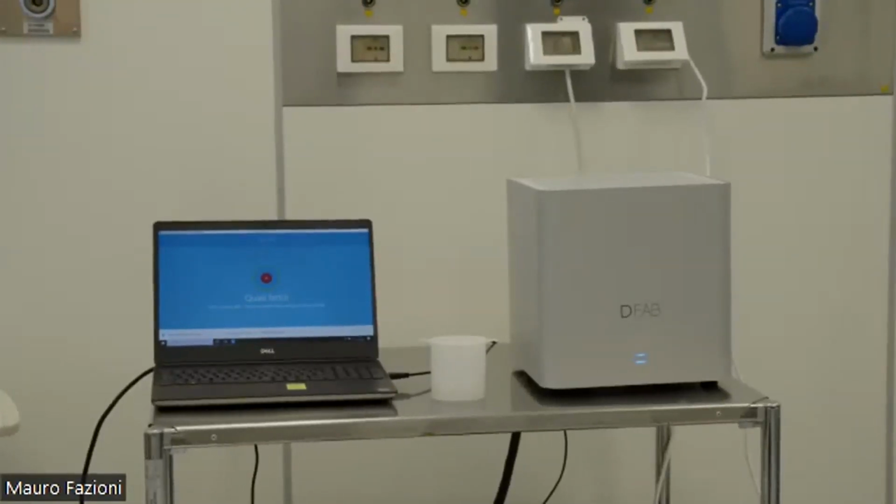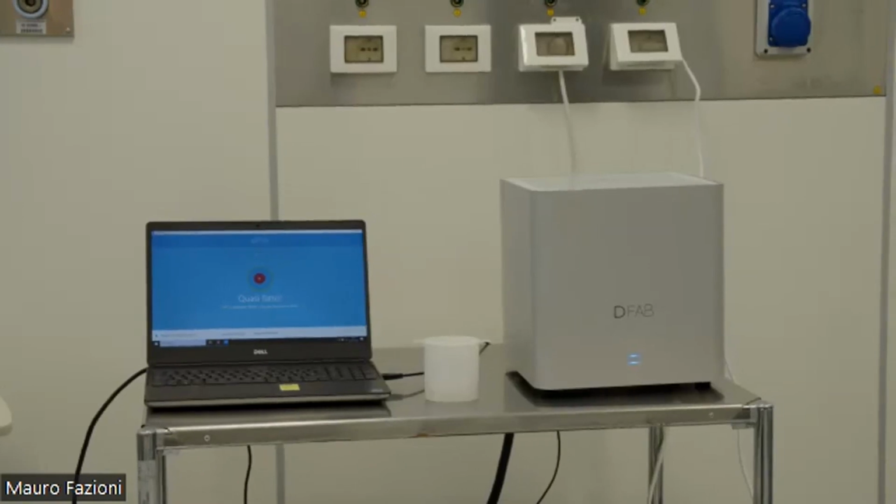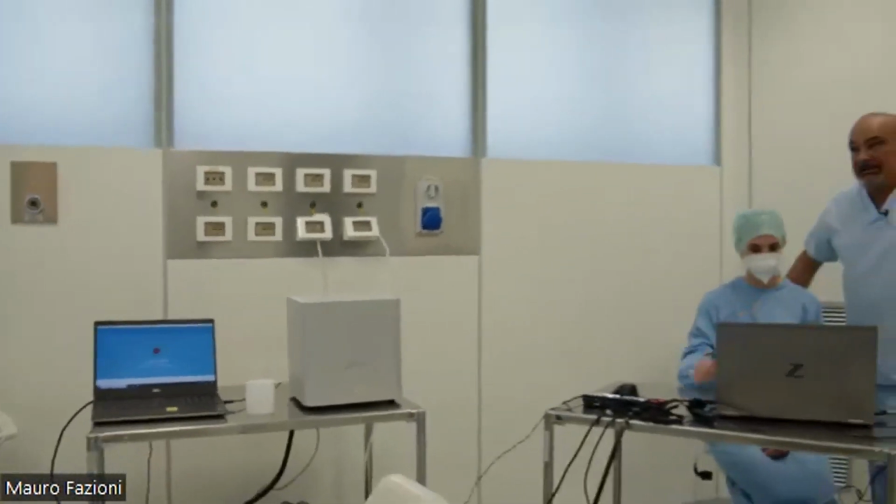One question about glaze for resin. Why do you avoid using glaze resin or light curing over the surface? Light curing, we have the post-processing, yes. So we can shake with alcohol, and after that, we can improve the post-processing with the curing for 20 minutes.